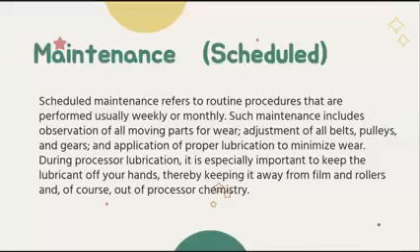Okay, no, sorry, rollers are not included because the lubrication fluid might damage or might infect your processor chemicals. Okay, so proper lubrication is for your belts and pulleys, gears, and for your drive motor devices. Okay, so during processor lubrication, it is especially important to keep the lubricant off of your hands, thereby keeping it away from films and rollers and of course out of processor chemistry.